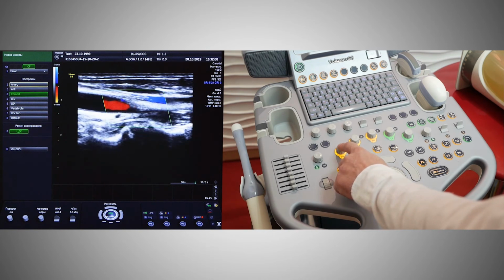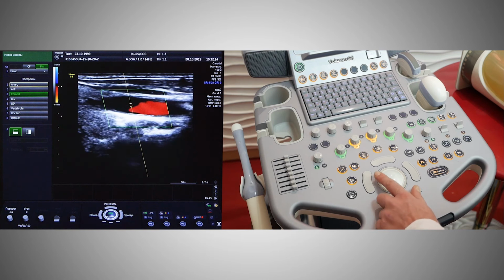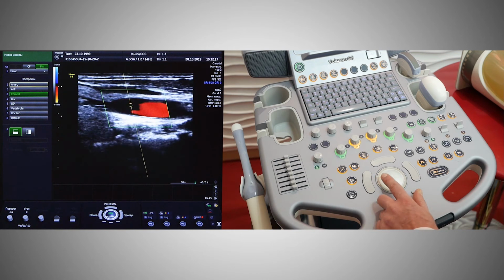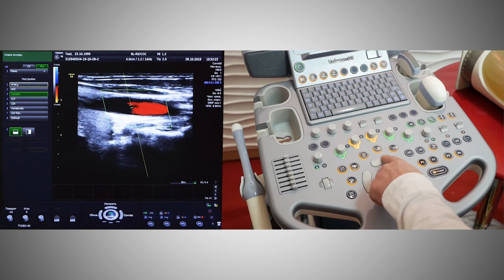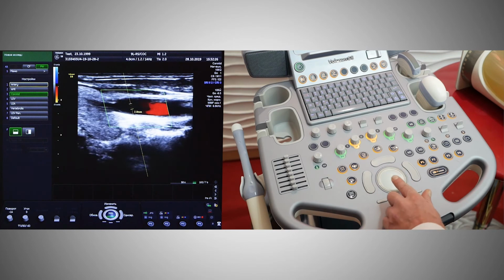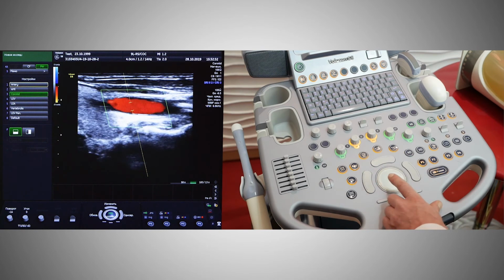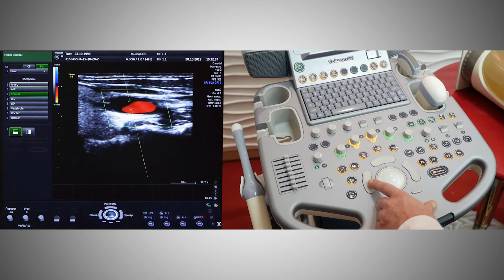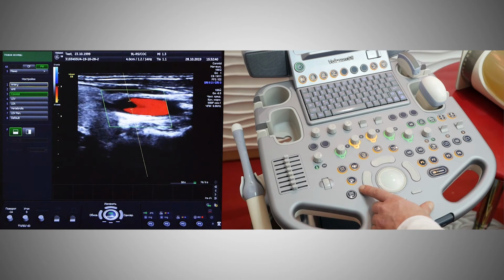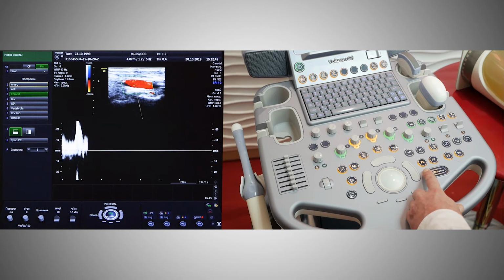Let's turn on the pulse wave Doppler, which we need for examinations on arteries. We choose the lumen of the vessel. Again, we use Change button to alter the control volume with the trackball. By pressing again, we change the position of the control volume. And then, as we can see on the screen to the left of the trackball, refresh. On the right, simultaneously. That is, it is a triplex mode.